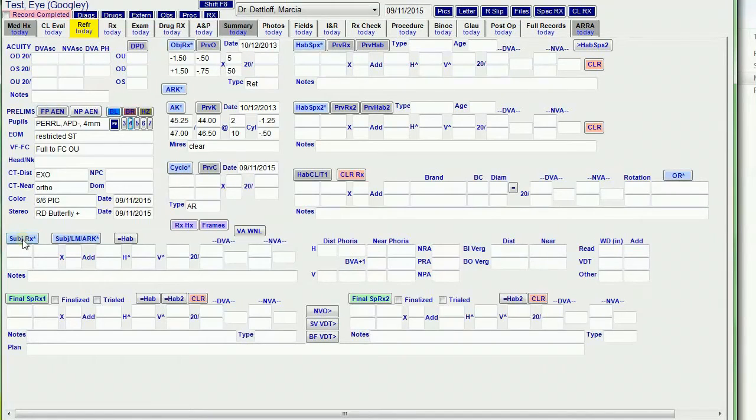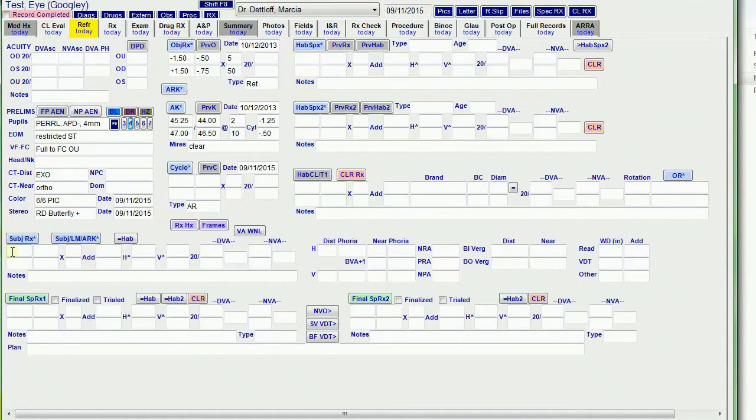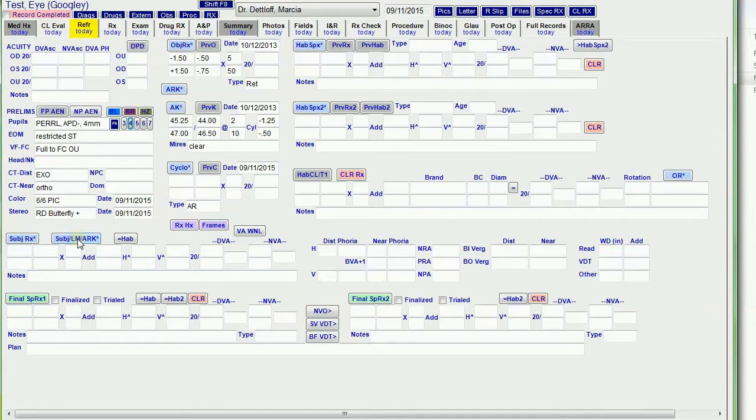This button pulls forward the subjective RX from the RT5100. I prefer to just import the subjective RX, and then I can make any modifications that I want in the final RX down here. This button pulls all the data.